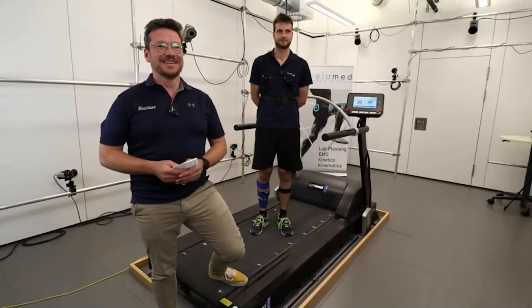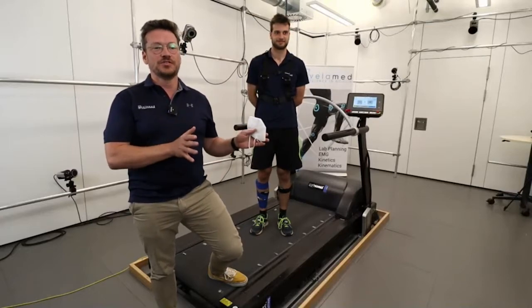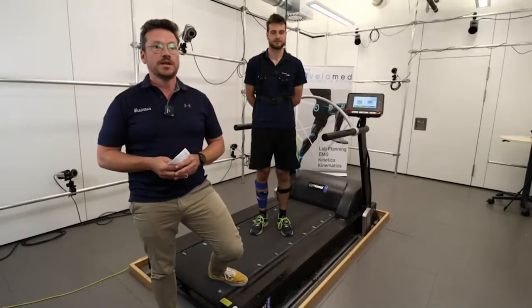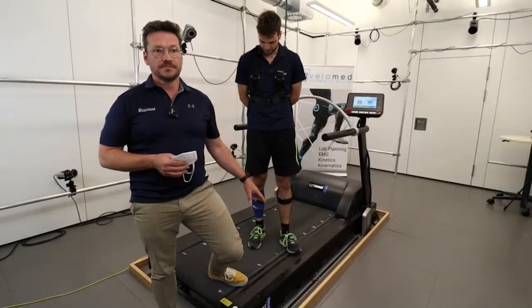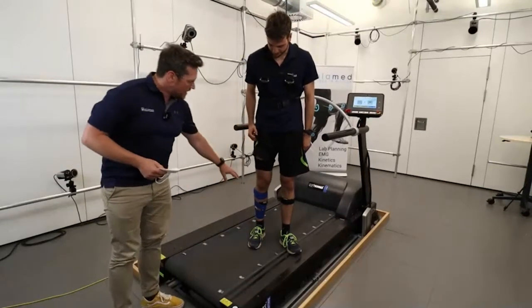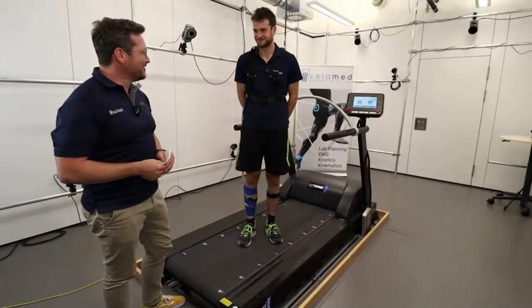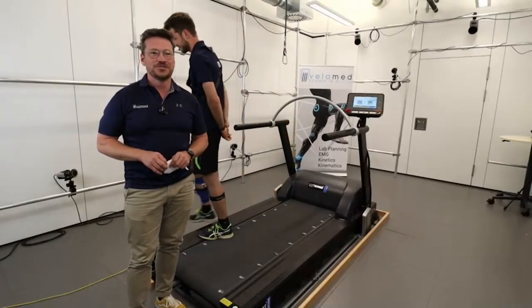So this time I'm standing here in front of the treadmill, and we will show our second setup that we are having here. In the first setup, we showed Qualisys QTM, recording kinematics and the ground reaction forces. In the second setup, we will be using the Noraxon MR3 software, recording the ground reaction forces, as well as the pressure distribution from the sensors of the treadmill, as well as the Noraxon IMU inertial sensor system, together with EMG. This time, my dear colleague Arvid will be running on the treadmill, and my dear colleague Jimmy will be doing the recording, and I hand over to Jimmy.